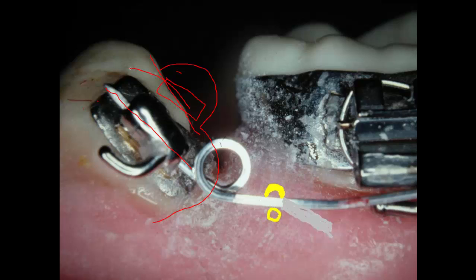And upright the tooth part of the way, and then bond the little tube onto another section of the tooth, and go ahead and pick the tooth up, and the tooth will end up with a space between the teeth, and it would be setting something like that when you get it setting up. This is a real nice way to upright the teeth.